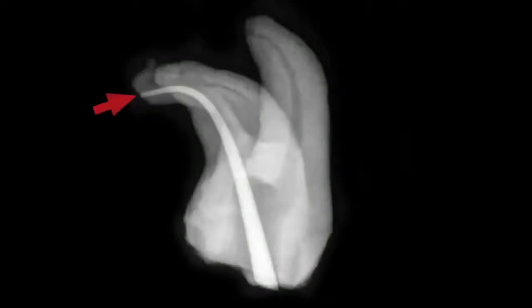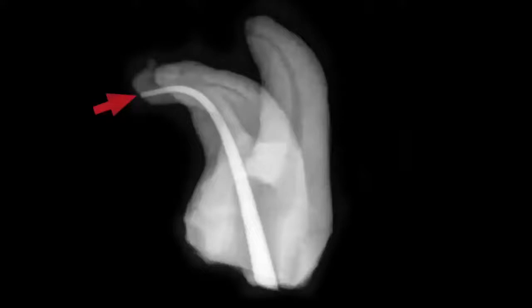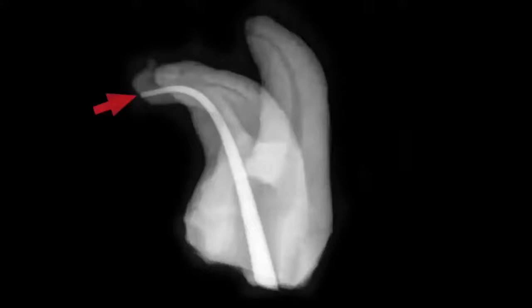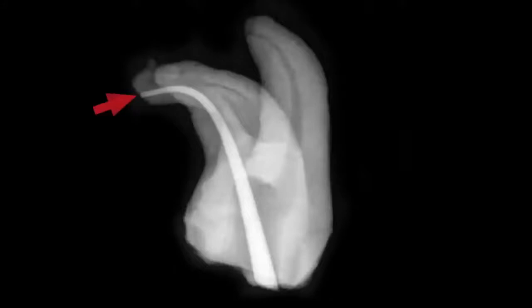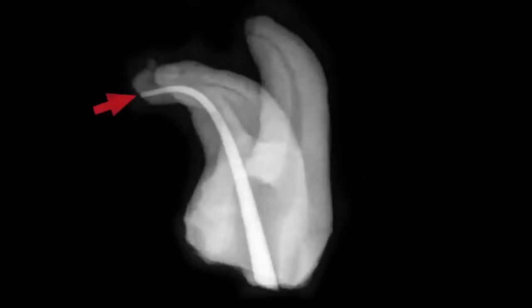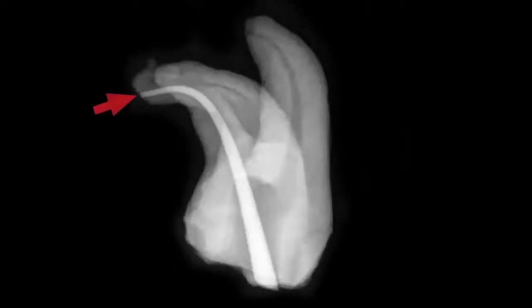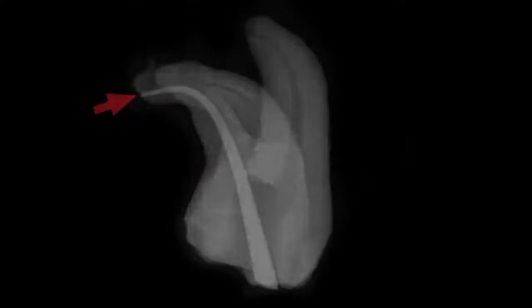Cone fit is a unique art in itself. The longer, more curved, and thinner the canals, the closer one wants to fit the cone. The straighter, wider, and shorter the canals, the further away the cone fits. Here I would cut back one millimeter for vertical compaction of warm gutta percha. For a carrier-based system, make your length one millimeter short of the finisher used to transfer the length.